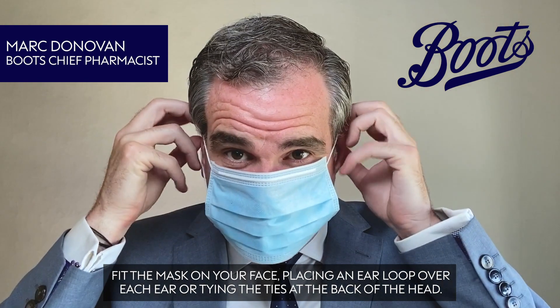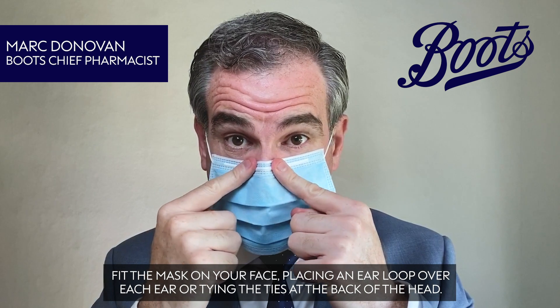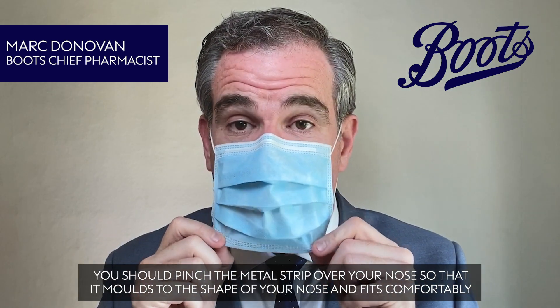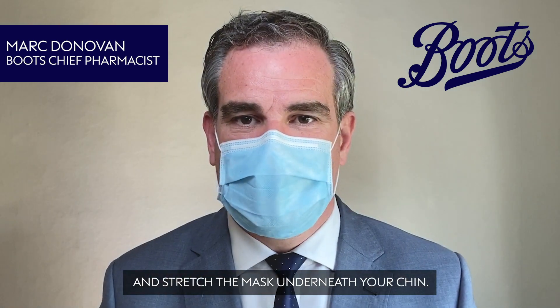Fit the mask on your face, placing an ear loop over each ear or tying the ties at the back of your head. You should pinch the metal strip over your nose so that it moulds to the shape of your nose and fits comfortably, and stretch the mask underneath your chin.